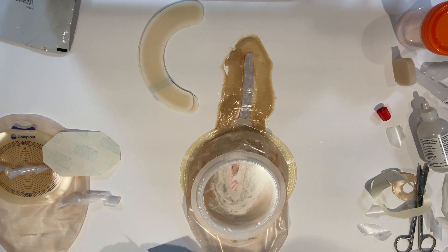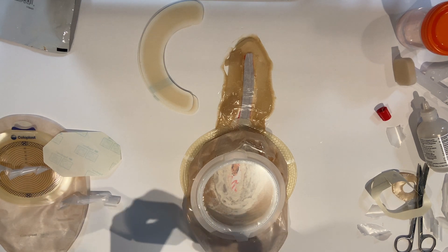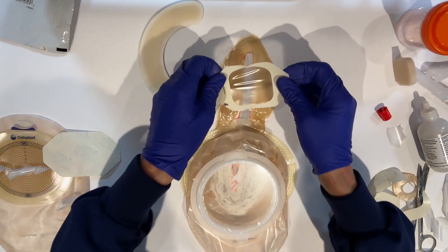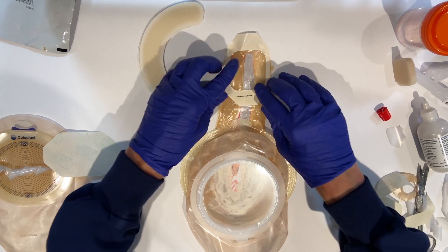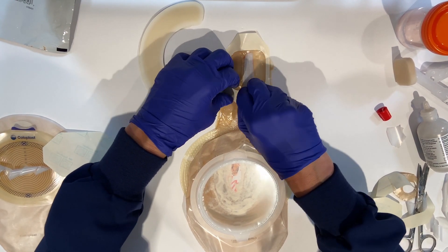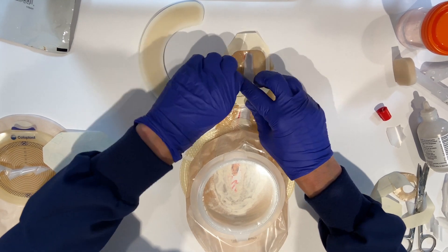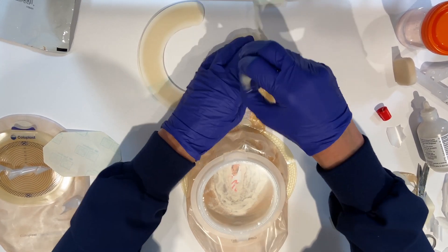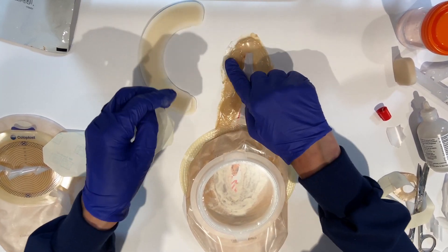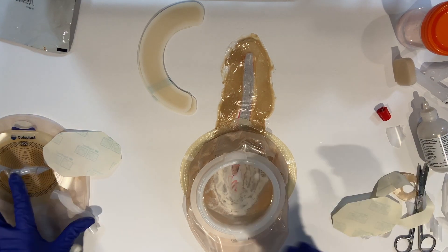Really, this technique is a combination of the sandwich technique and using your advanced wound dressings to allow your patient to be in a more sturdy pouch — maybe a little bit more inexpensive of a pouch. You can use a two-piece system if you'd like, and then you can just change that maybe twice a week. It's awesome — good times.